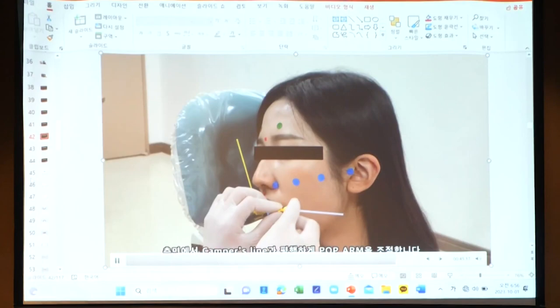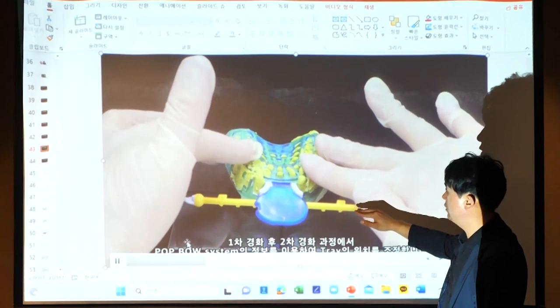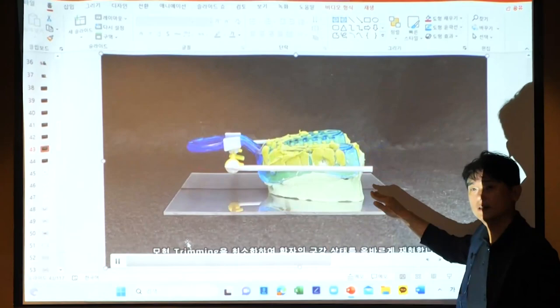And then, you can pour the gypsum stone like this. So parallel with this base, parallel with the pop stick. No? And then after removing this tray, you can see the occlusal plane automatically. Okay?